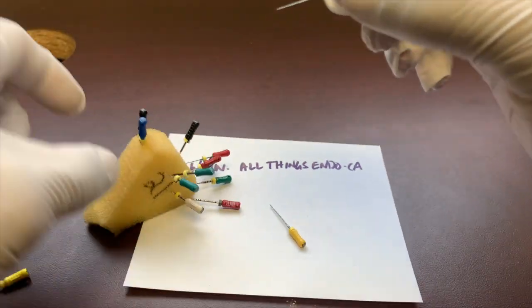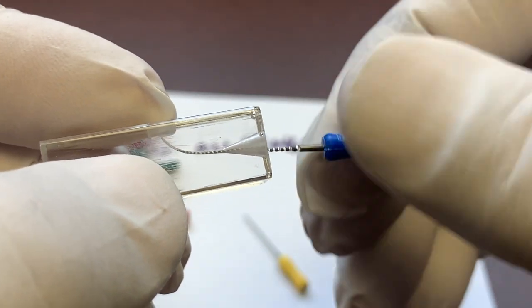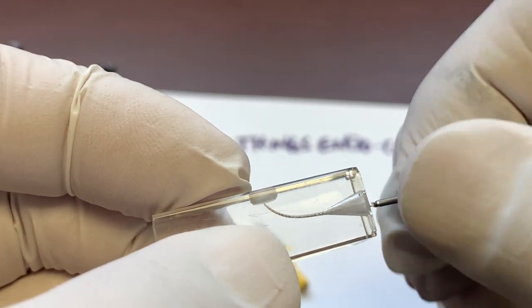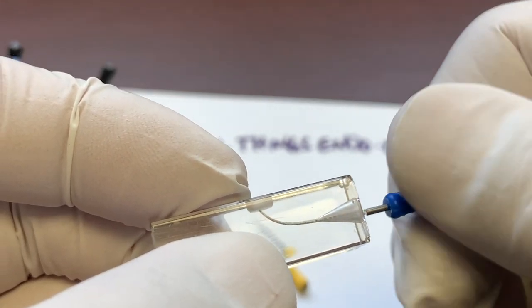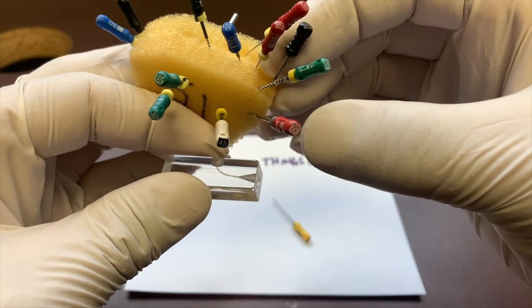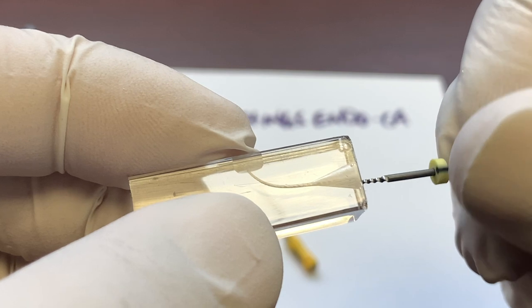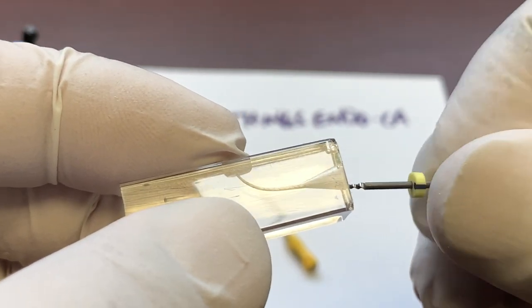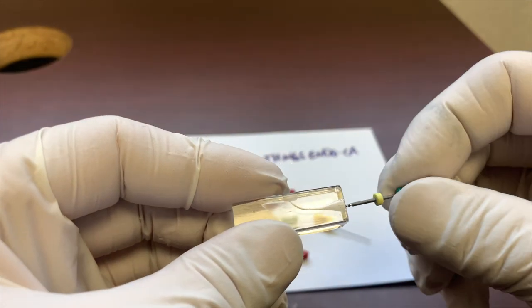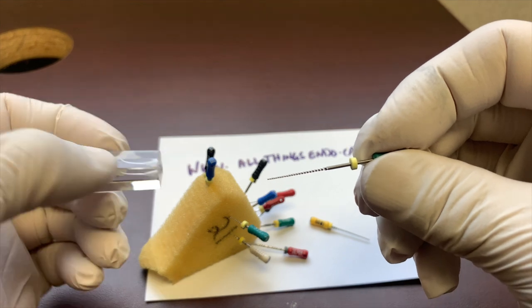So let's just go with a 30. And we'll do the same thing again. Quarter turn in. Counterclockwise turn, apical pressure. Quarter turn in. There we go. And you can see the debris again. Let's go to a 35, same thing. I'll do three cutting cycles and then you've got to clean your files, clean the flutes. Obviously you're going to be irrigating. I don't have an irrigating syringe with me. And there's more debris. So that is one way to do that.